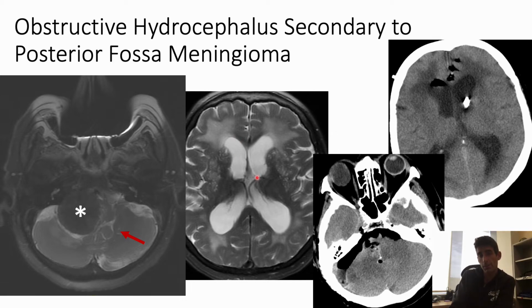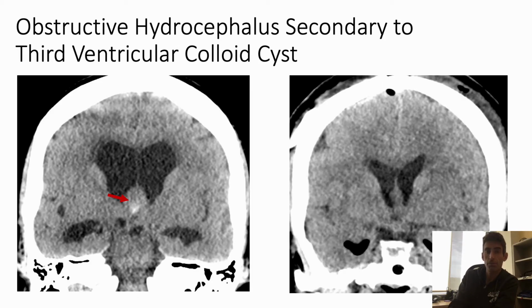And what's interesting is this patient was elderly, probably had this tumor for a very long time, and never had medical care. Even if you take out the source of obstruction, oftentimes with long-standing hydrocephalus, the patients never get over the hydrocephalus. So here she is, after the tumor's out, the ventricles remained rather large, and she ended up needing a shunt for permanent CSF drainage.